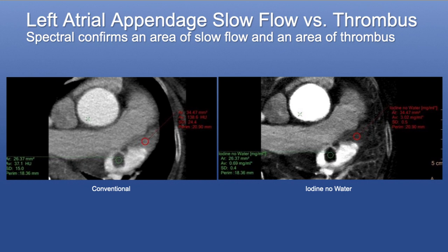The advantages are obvious. So there was a paper from Jorge Romero, and now he's at Brigham, and Mario Garcia from Monty, a meta-analysis where they looked at the sensitivity, negative predictive value and positive predictive value of CT. And they found that it was above 92% when you compare with TEE.